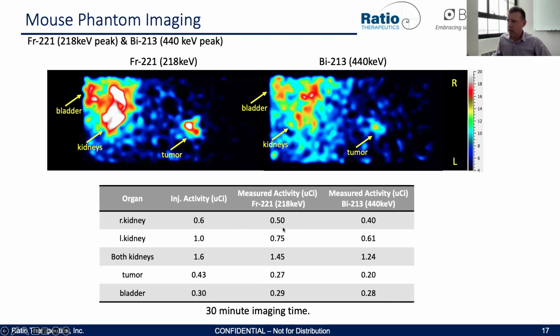So we still see the rank ordering very similar to what we would expect given the known activities. Clearly, we have noise, and this is a nice little word of caution: if we're going to do xenograft tumor imaging, think about where that tumor placement should be relative to some other potential areas of high uptake in the images, in the animals.